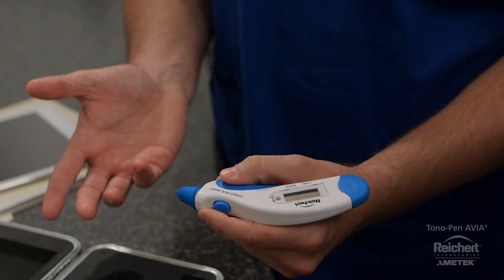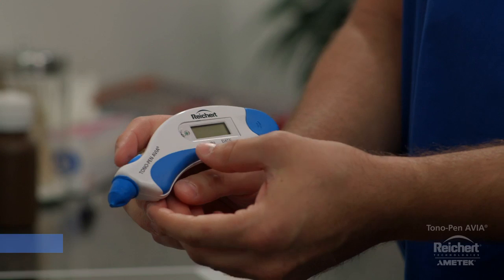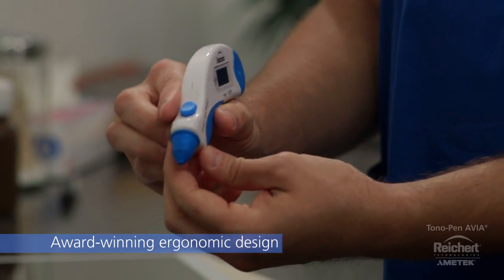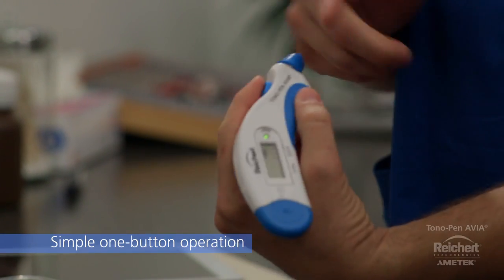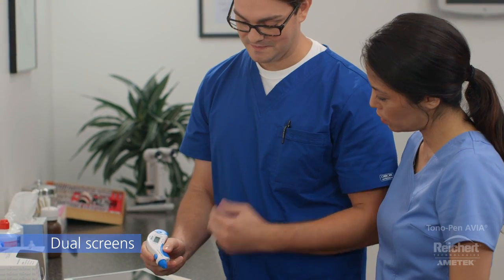With its award-winning ergonomic design and soft touch grips, the lightweight Tonopan Avia fits comfortably in any operator's hand, ensuring consistent measurement technique among users. The simple one-button operation is intuitive and the large dual-sided display is easy to read and suitable for both right or left-handed users.